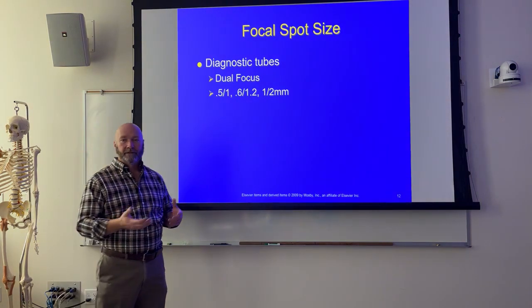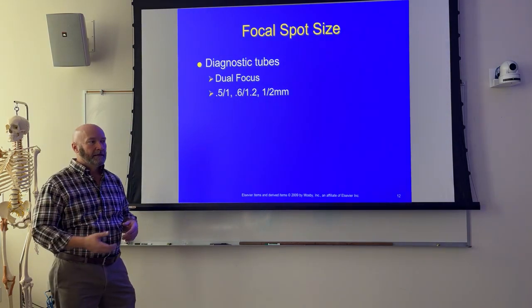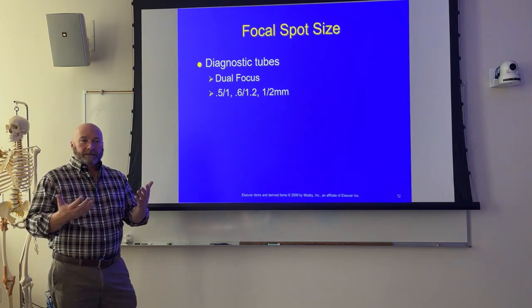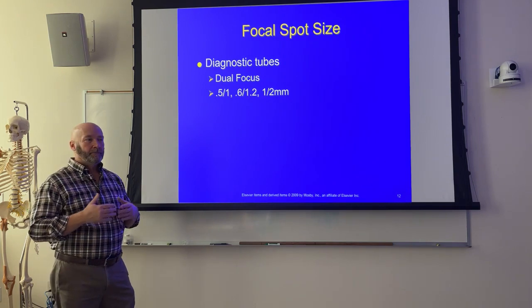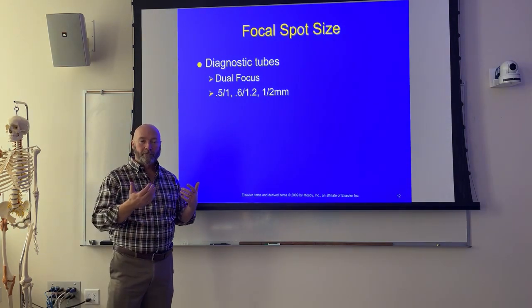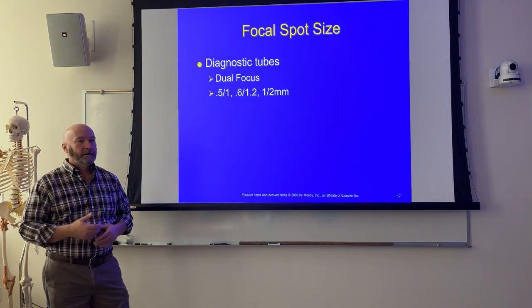The downside there is that you're going to lose some sharpness for recorded detail. We talked about that in the last section and last semester as well. Because of the way that the electrons come off of the anode, you're going to lose some sharpness for recorded detail. We have words for loss of sharpness of recorded detail and good sharpness for recorded detail.